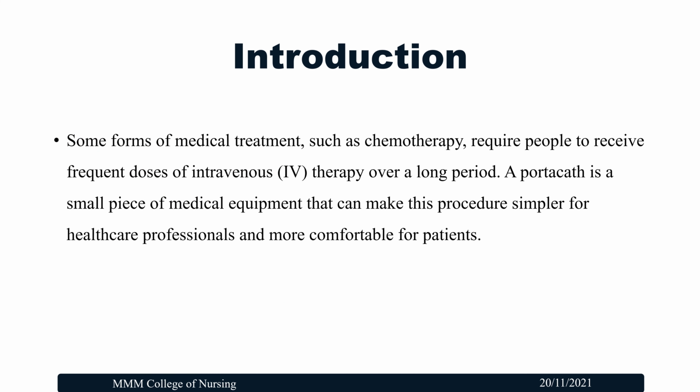Introduction. Some forms of medical treatment such as chemotherapy require people to receive frequent doses of intravenous therapy over a long period. A Portacath is a small piece of medical equipment that can make this procedure simpler for healthcare professionals and more comfortable for patients. As its name suggests, a Portacath is a combination of a portal and a catheter. Some people refer to Portacath as ports.